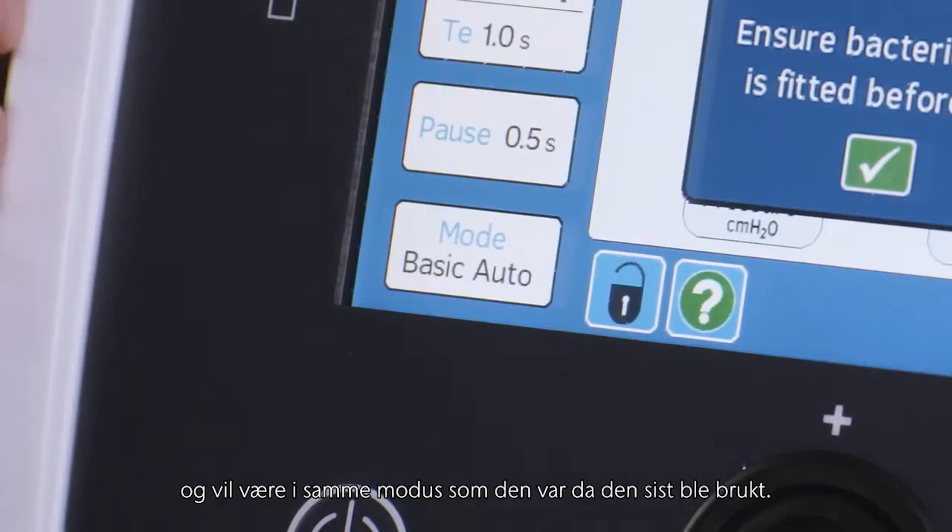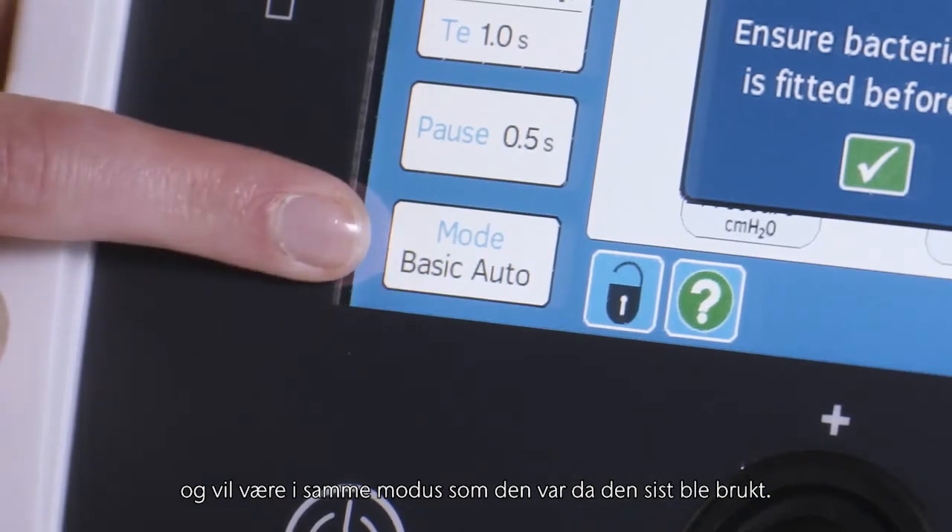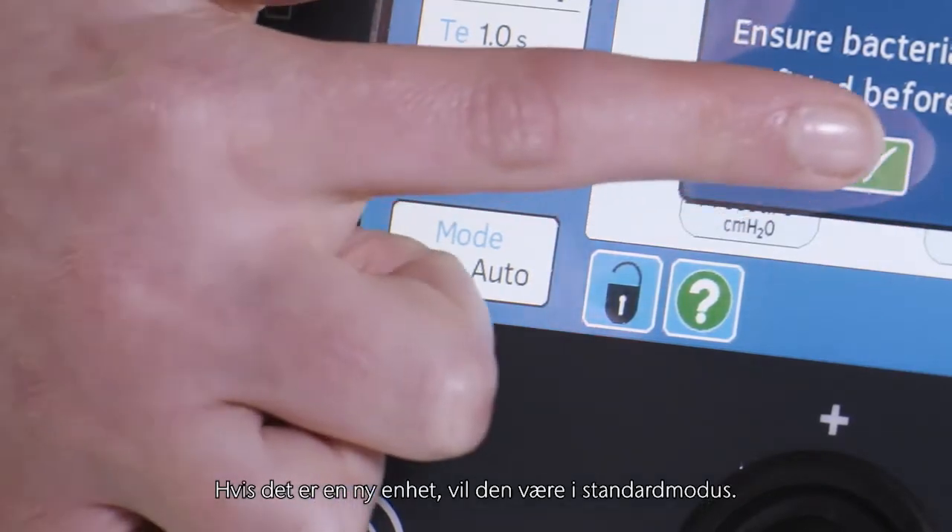The device will boot up and be in the same mode as it was when it was last used. If it is a new device it will be in the default mode.